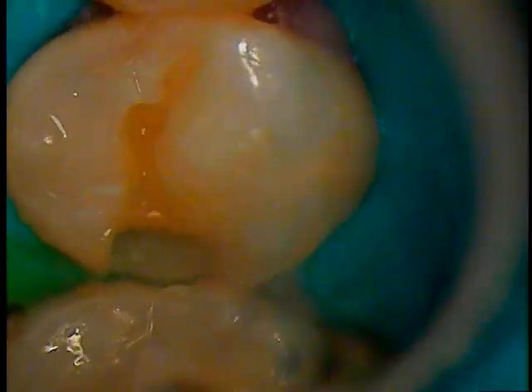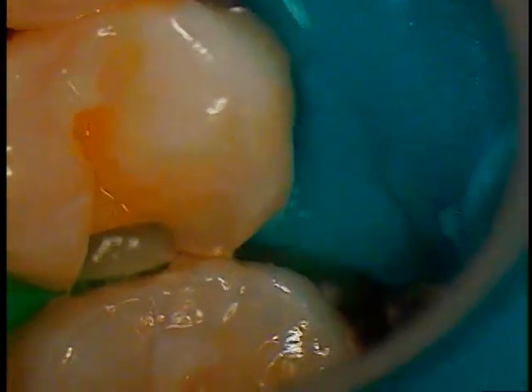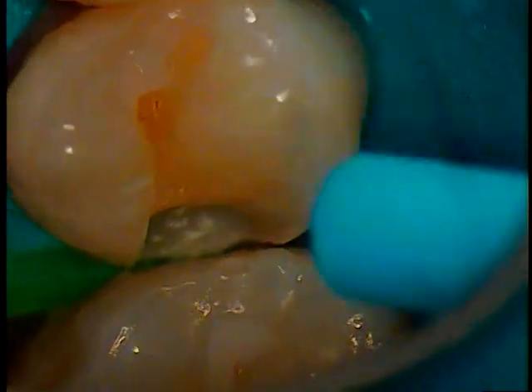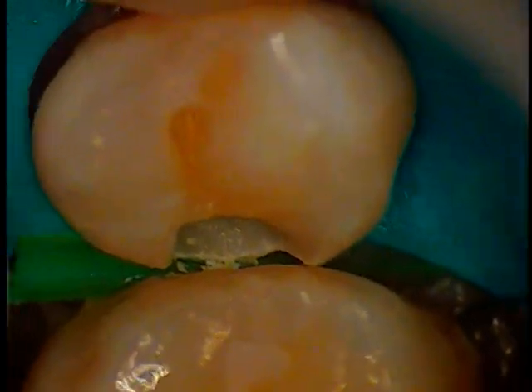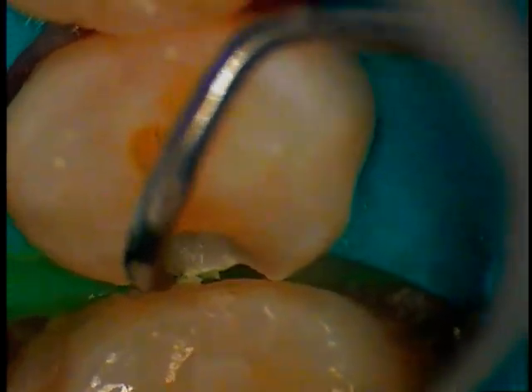All right, air in the mirror. On the mirror, please. Thank you. Okay. Looks like we've got everything under control now. I'll take my scaler again, and we'll just clean that up.